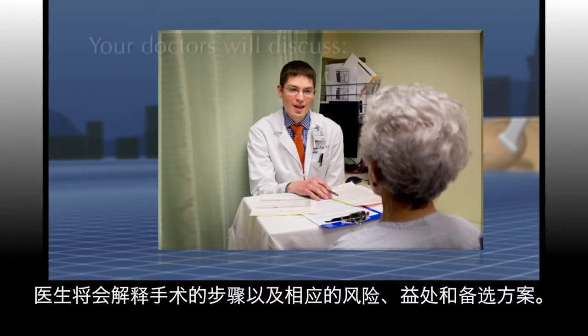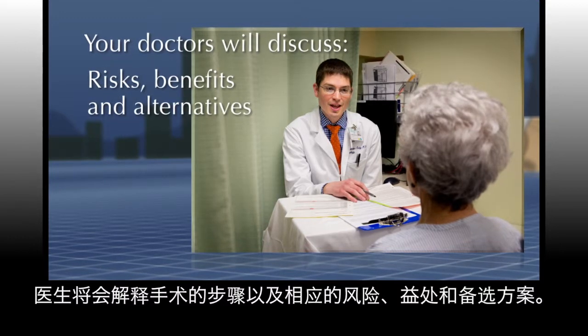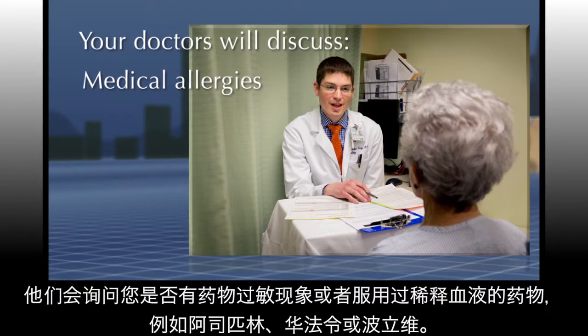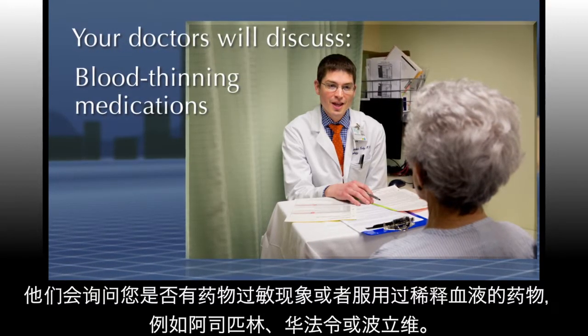Your doctors will explain what will happen during the procedure as well as the risks, benefits, and alternatives. They will ask you about any medical allergies you have or blood thinning medications that you take, such as aspirin, warfarin, or Plavix.